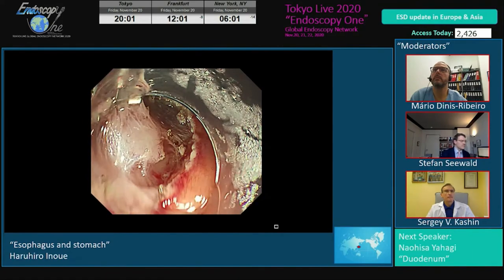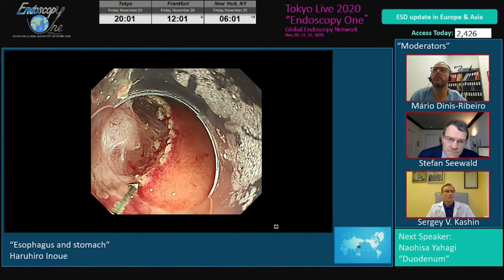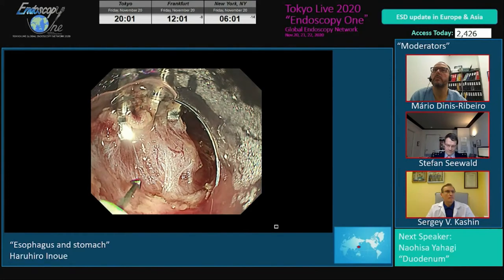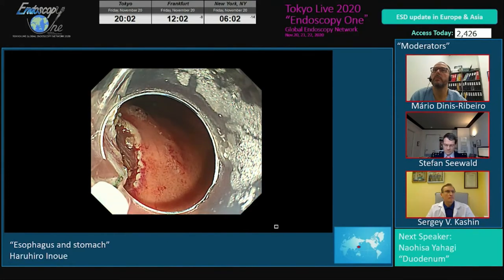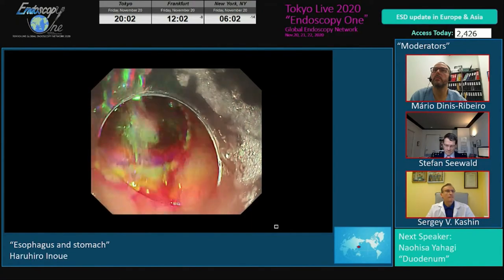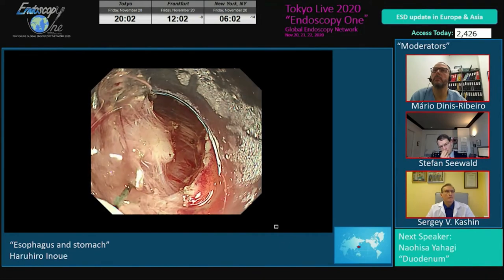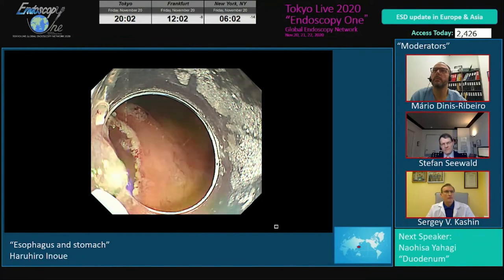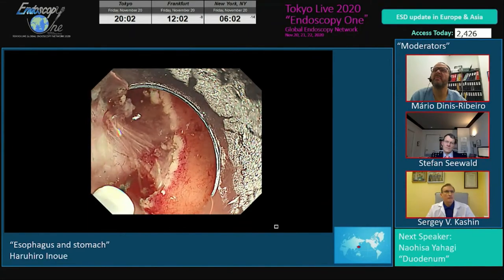Now we are dissecting. The tumor is embedded beneath the muscle layer. So we carefully dissect. This is a muscle fiber together with the very, very thin muscle layer of the upper part of the stomach. So muscle fibers, this must be a muscle fiber. We are dissecting it very carefully.